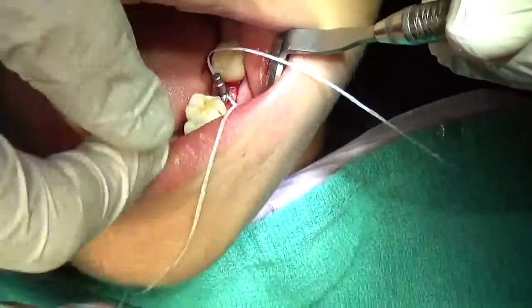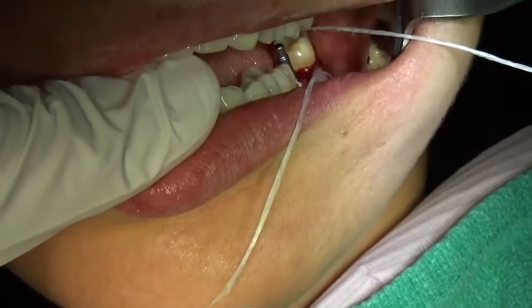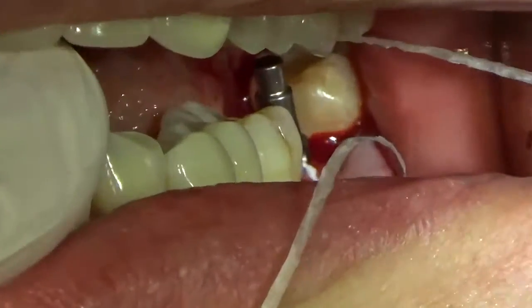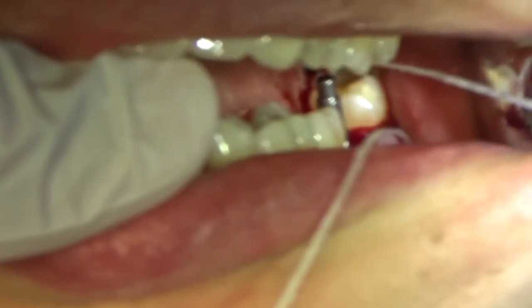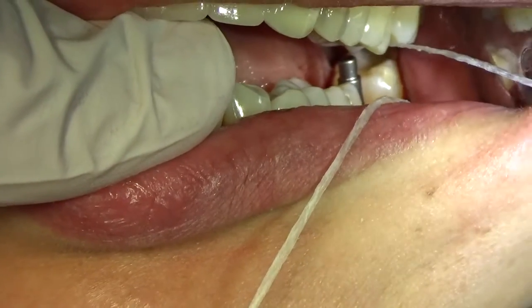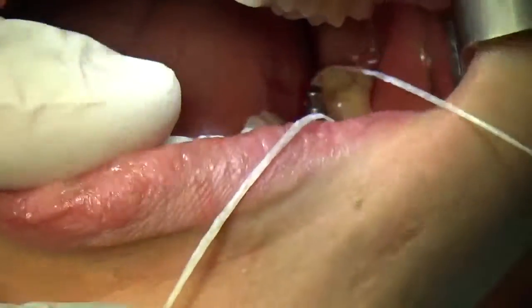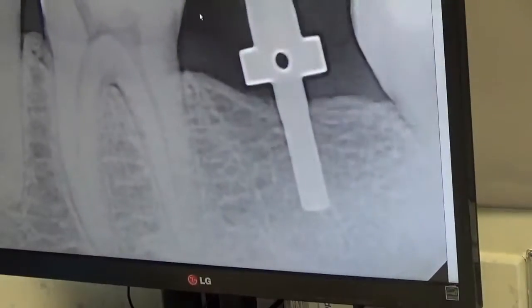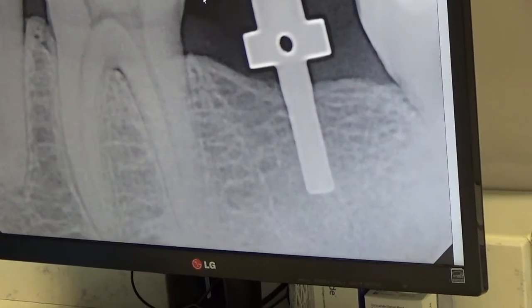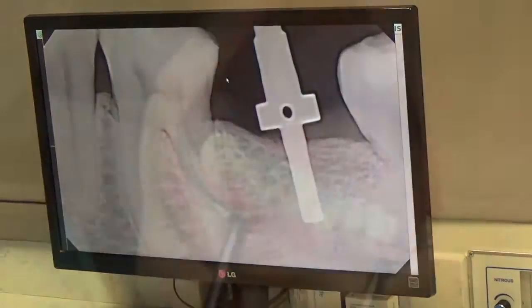And one more thing, muy suave, is I can see approximately, perfecto, when she's closing down right there, where is she closing? She's closing right on that palatal cusp of number 15 there. Gracias. So, all right. Is this approximately the plan that we had with our Blue Sky Bio software? Yes. This is definitely the plan. Nice job, Dr. Romero.